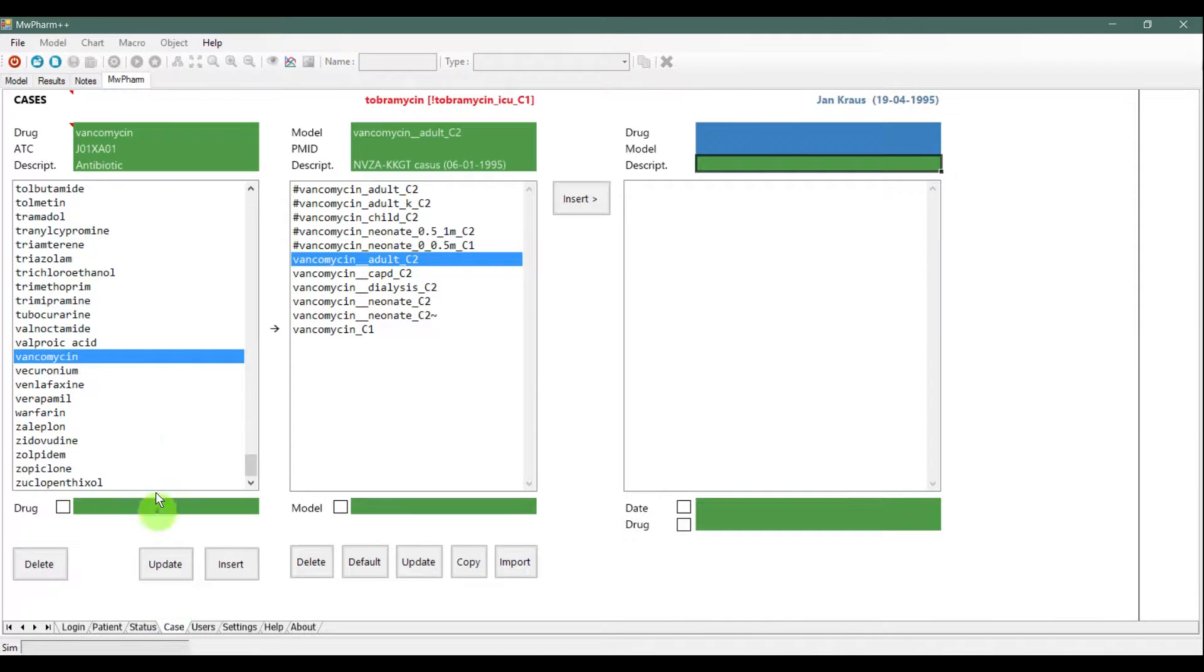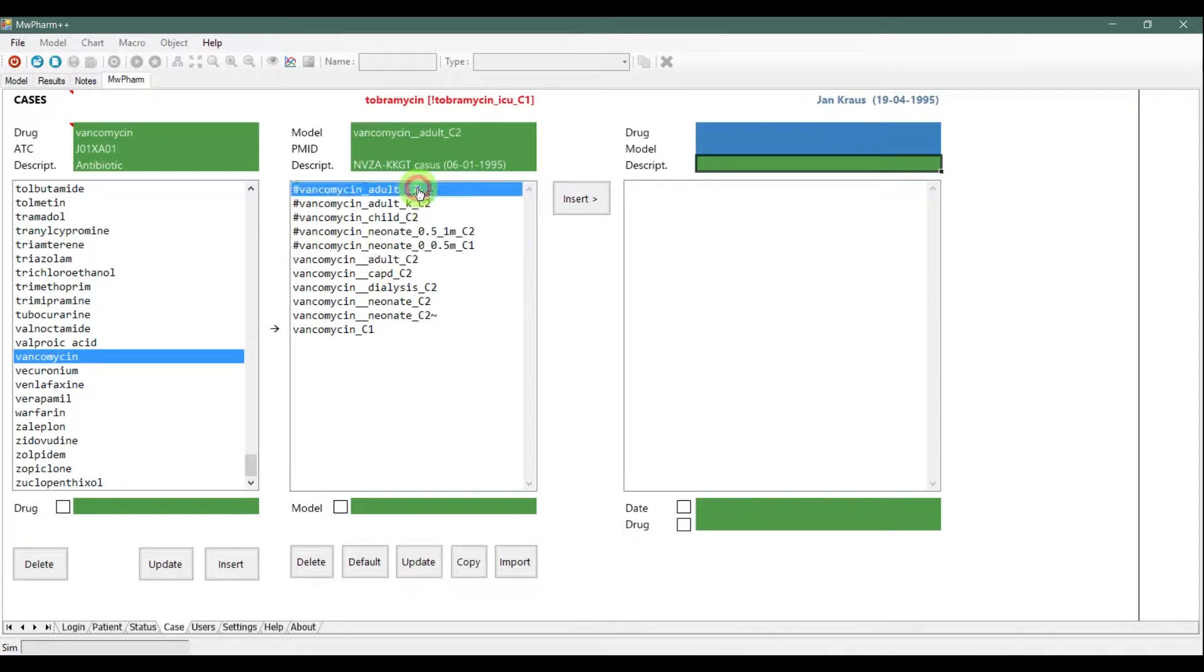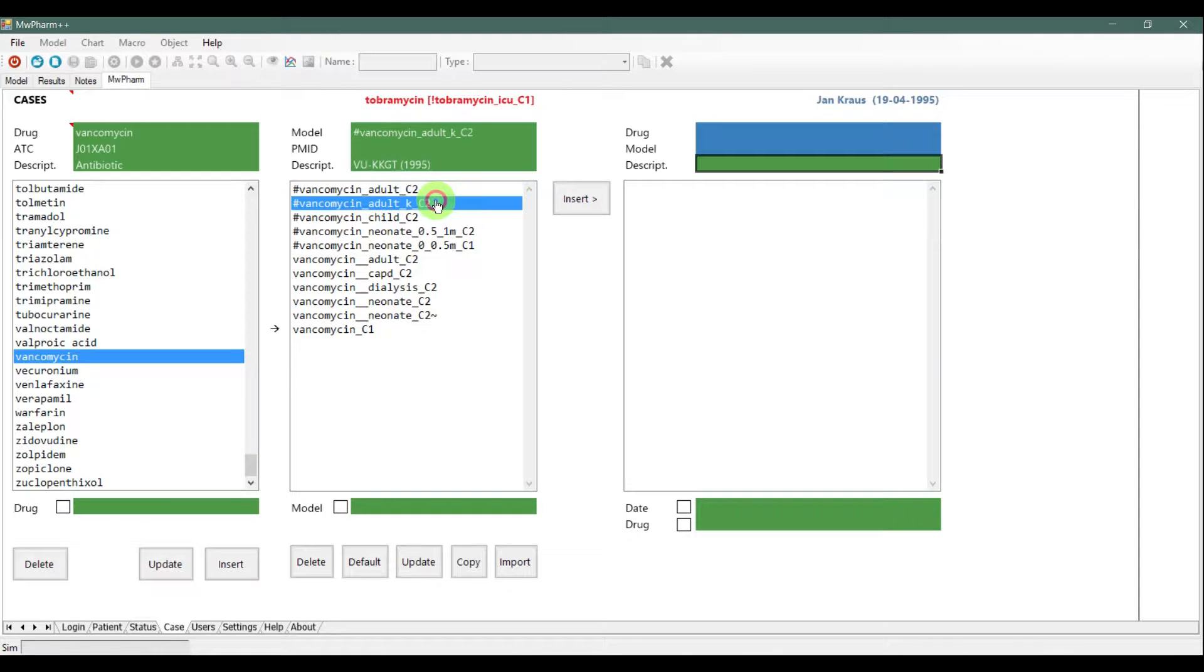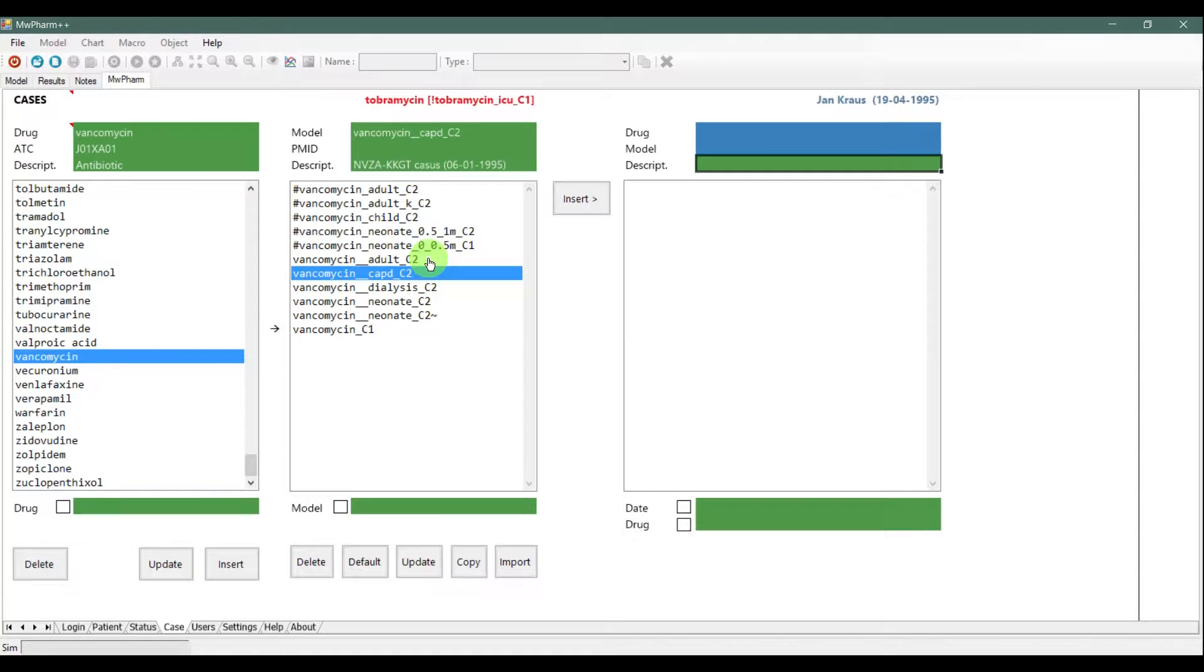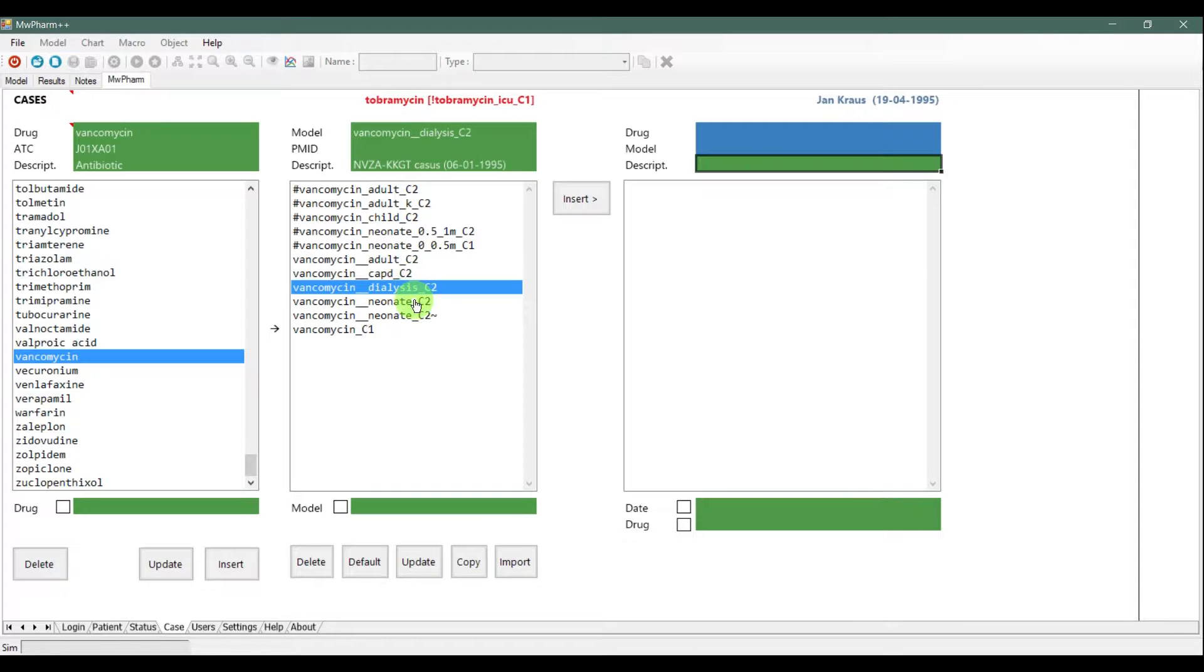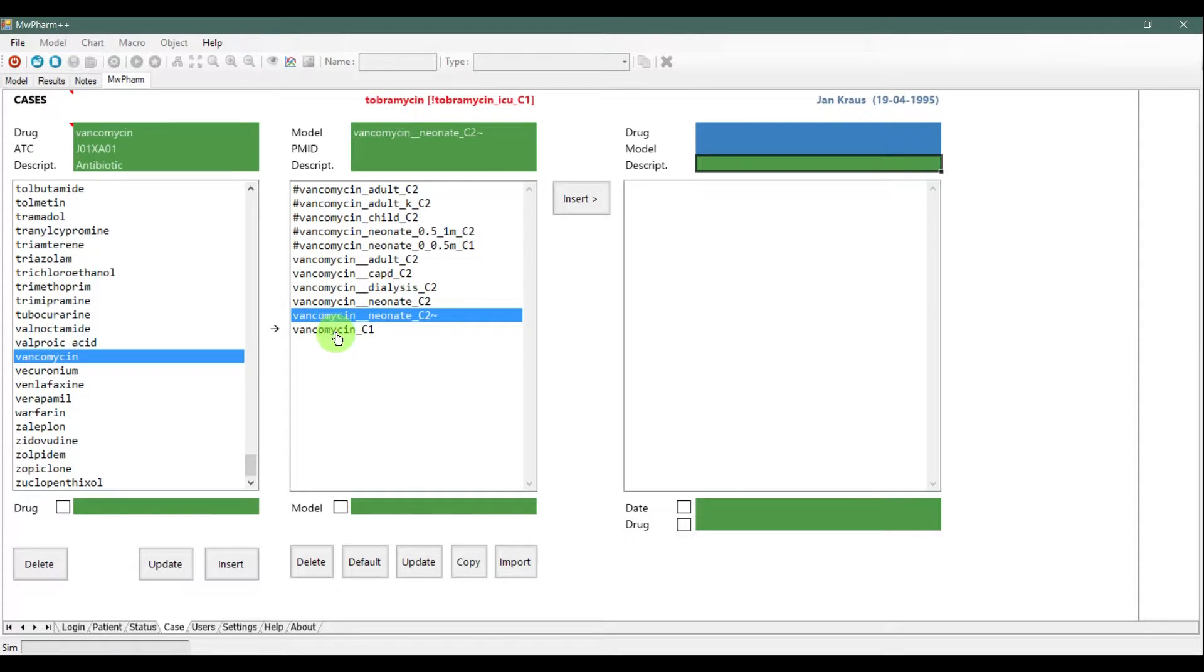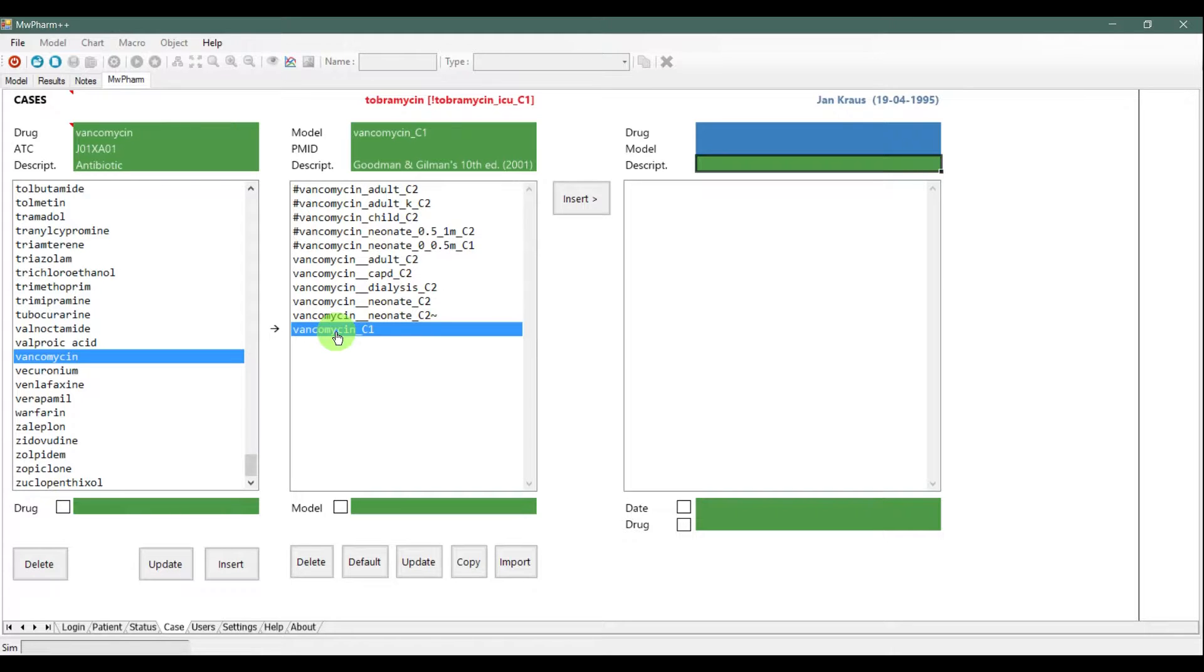Now, go back into the case tab and select a drug you want to use. In our example, we will use vancomycin. When you click on it, you will be able to choose a model for your drug application. For some drugs, there is a lot of models.